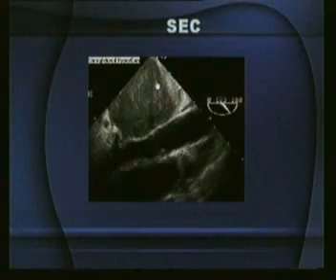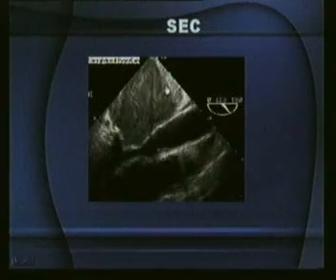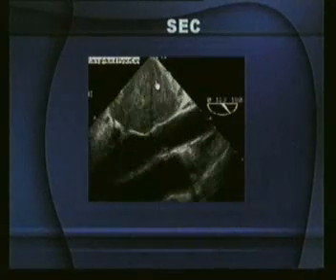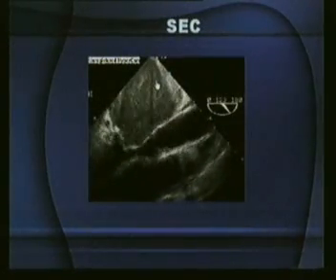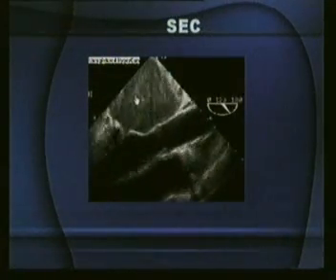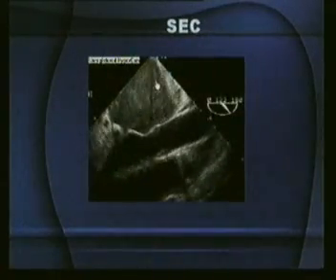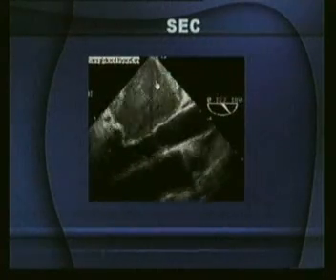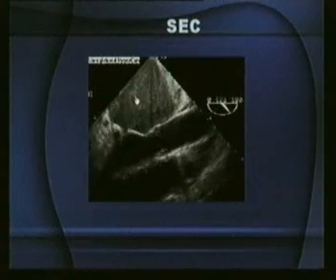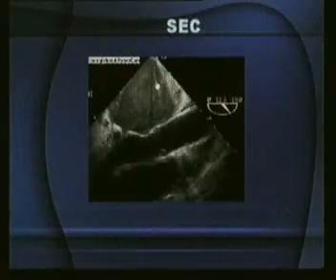This is spontaneous echo contrast. You have to know what spontaneous echo contrast is. This is not a clot, but this is a thrombogenic state in which there is rouleaux formation, and this indicates a high risk for systemic embolization but does not preclude a BMV. And these are some of the studies that we have done on spontaneous echo contrast on transesophageal echocardiography. Mind you, this can be present in patients of normal sinus rhythm also, and people with normal sinus rhythm can also embolize. So don't think that it's only AF which causes it. Thank you very much.